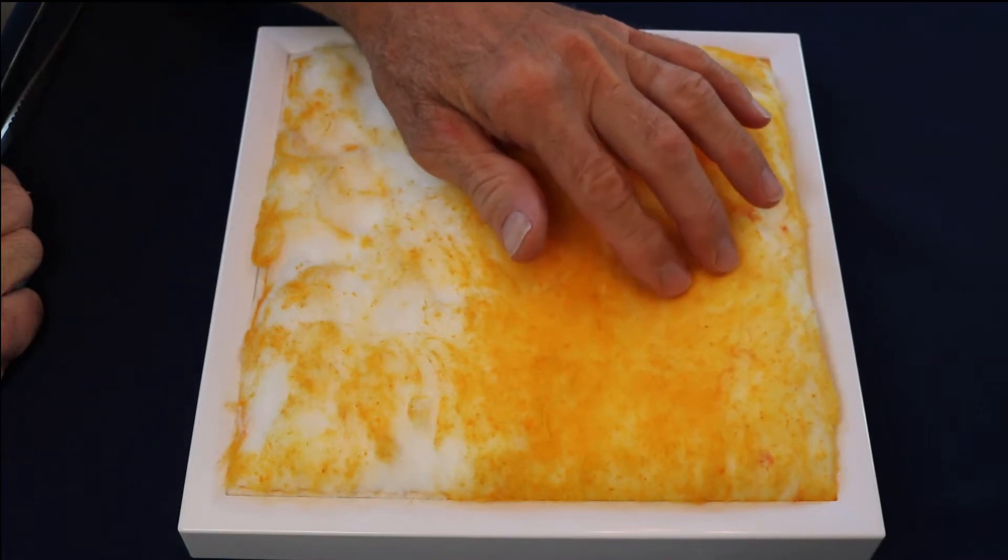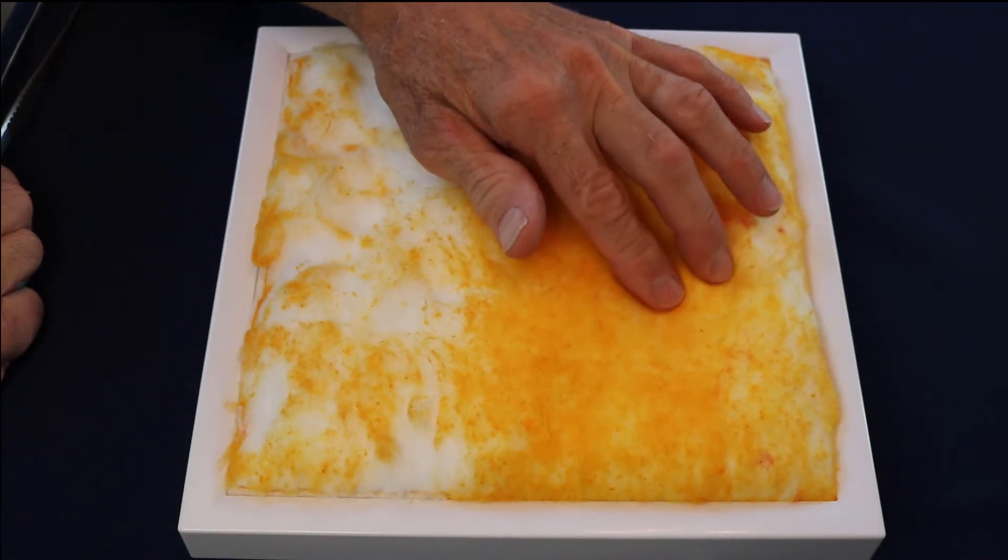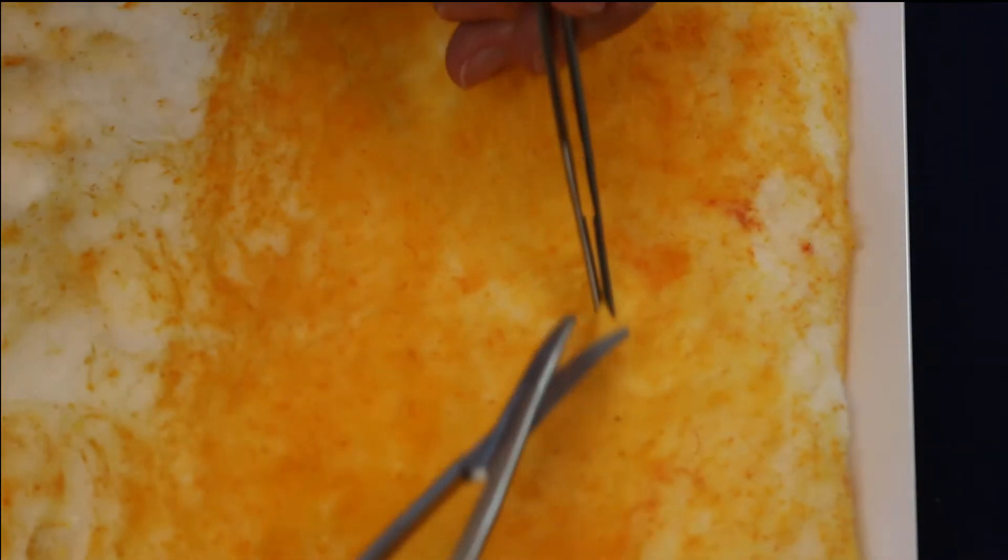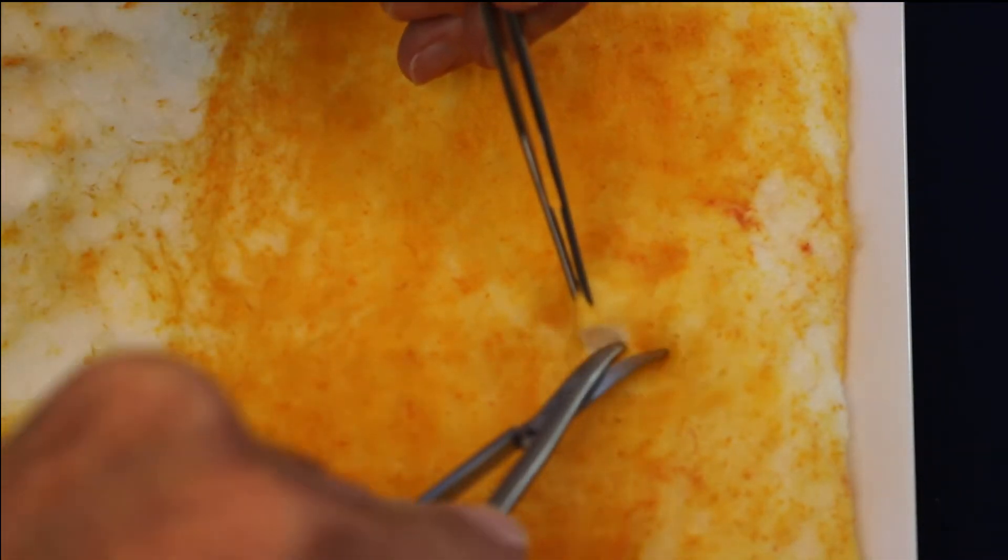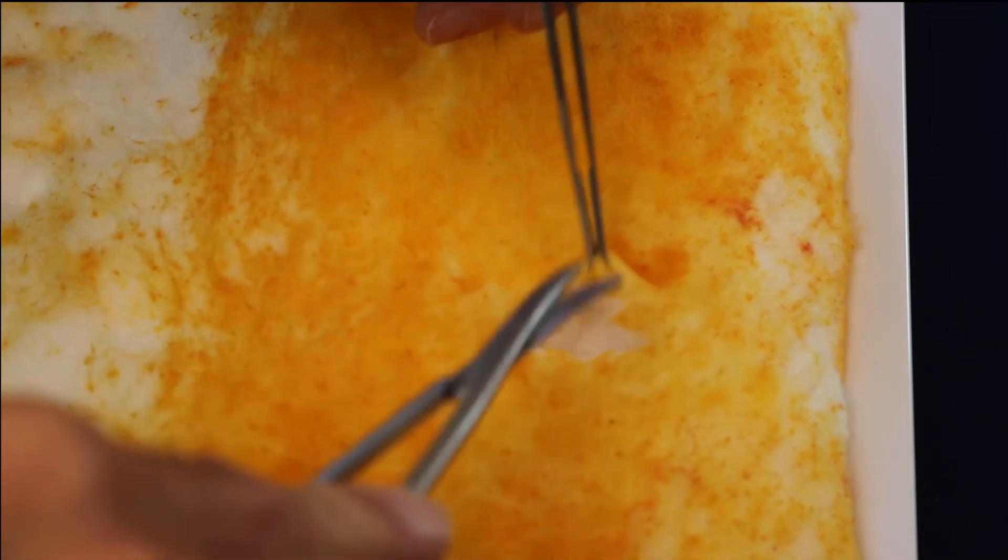Let's start at the top. Locate one of the small masses. With your scissors, open up the simulated subcutaneous tissues vertically, making sure that your opening is larger than the structure to be removed.